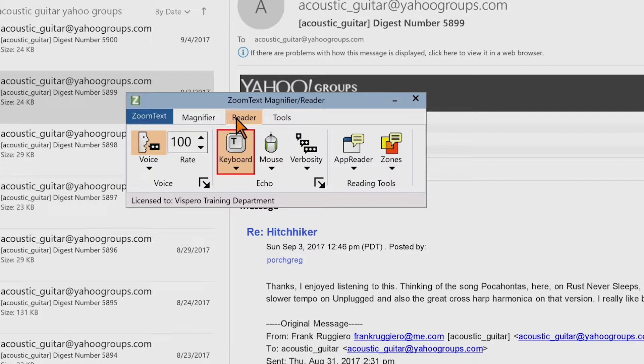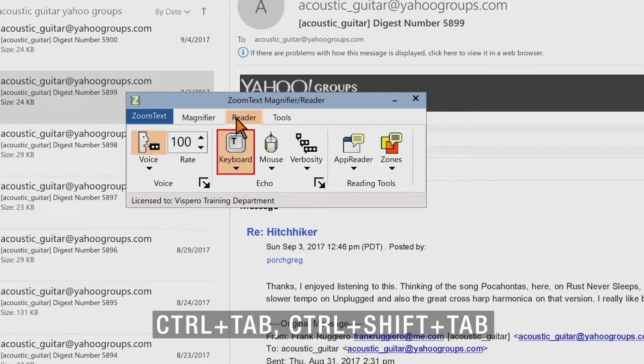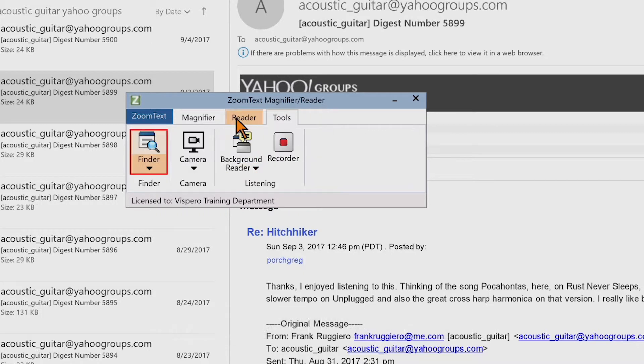You can also use the keyboard to move among the tabs by pressing Ctrl+Tab or Ctrl+Shift+Tab. Pressing Ctrl+Tab moves to the Tools toolbar tab. Here on the Tools toolbar tab you'll find controls for ZoomText Finder, camera, and listening features.